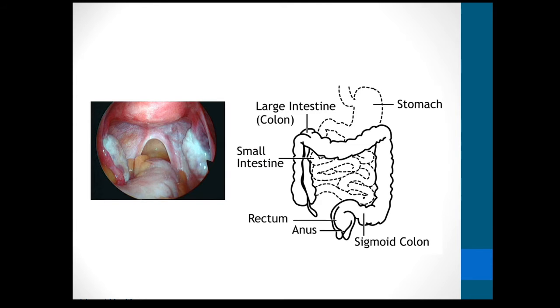So just refreshing the anatomy. So these are the uterosacral ligaments. The bowel runs in between both, and then from there it will often go to the left and up. And with ultrasound, we can probably assess approximately this area of bowel. Approximately 25 to 30 centimeters of bowel can be assessed with ultrasound.